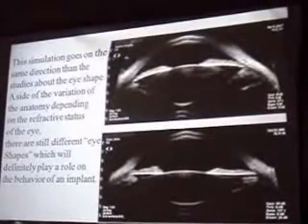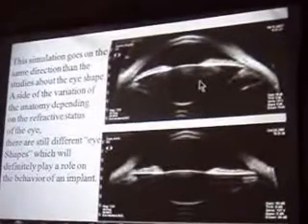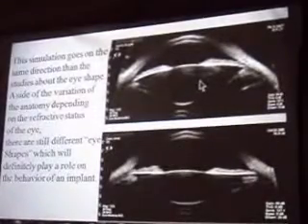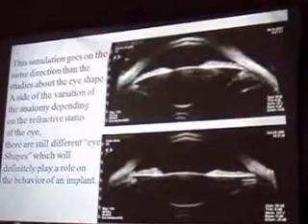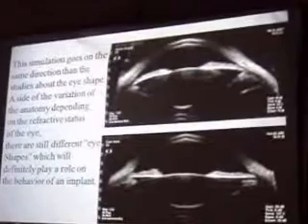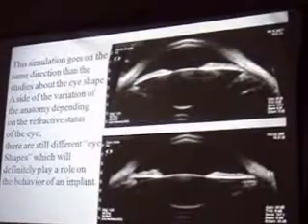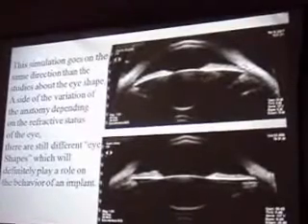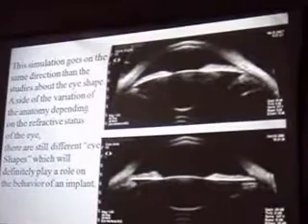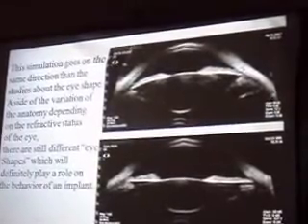In other words, the refraction circumstances are going to decide, or force us, or we're going to decide, to implant an ICL, and an ICL in the eye on top is going to have a completely different, easy way to create its own space depending on which eye shape you have.